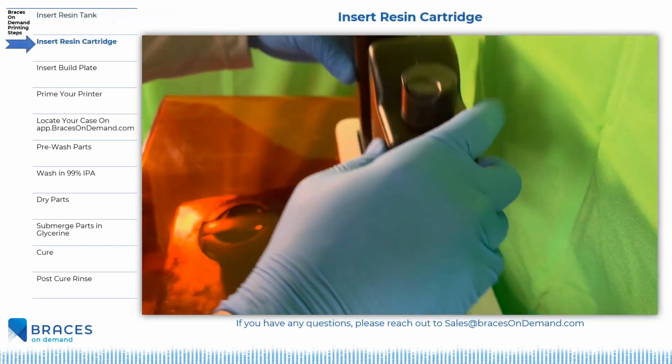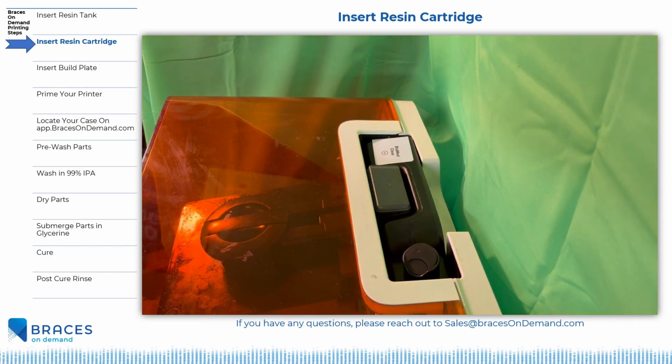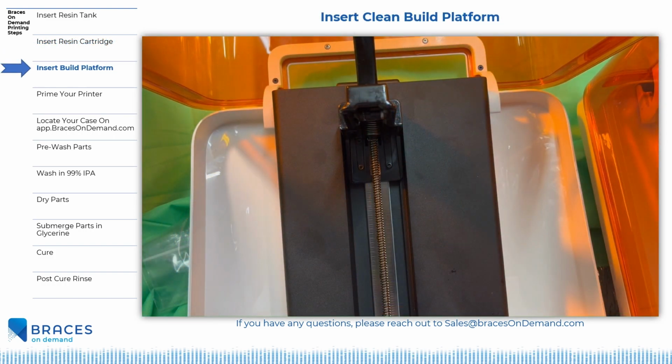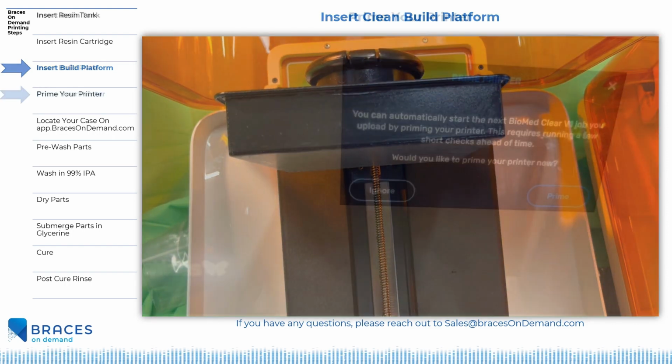Next, shake your resin cartridge to mix your resin and insert your cartridge. Open the ventilation cap. The last step before you can prime your printer is to insert your clean build plate.